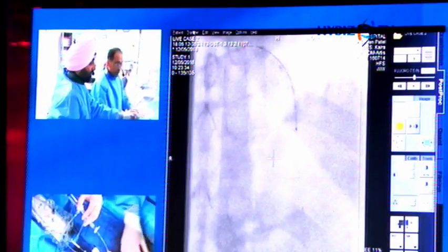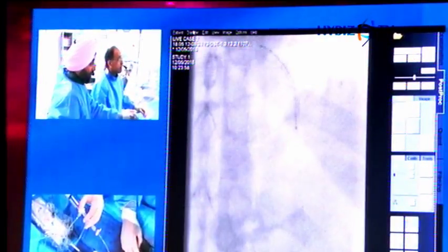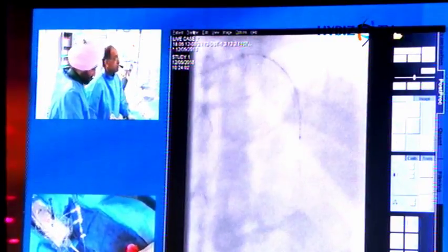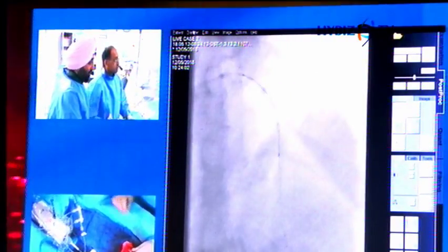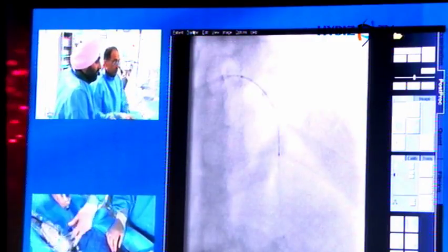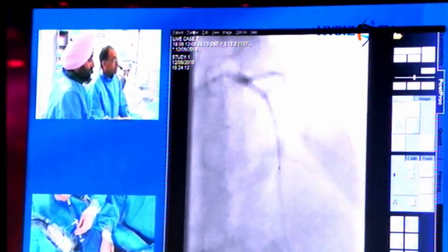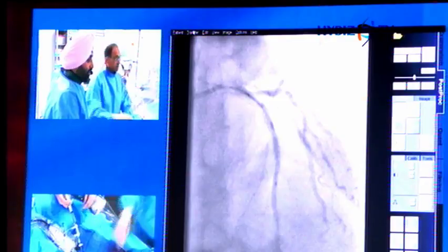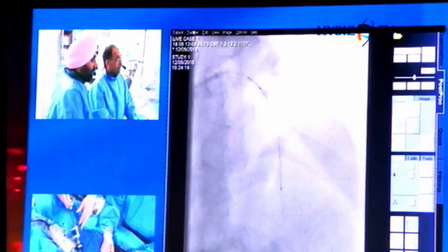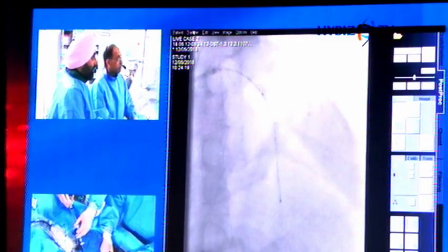Okay, test please, thank you. I think the way I look at it is if you're treating a proximal LAD or a mid-LAD, you want to have the ability to provide outcomes that are equivalent, if not better, than the LIMA, and so imaging is almost mandatory in a subset of that nature. I've got good clearance. You need to go beyond the stent. I want to see the end. We just get the whole thing because we're going to do the whole stent expansion.